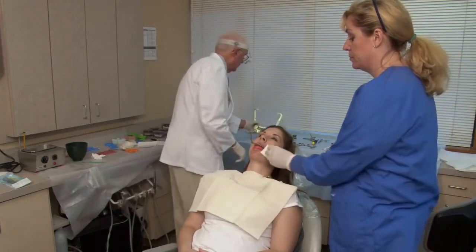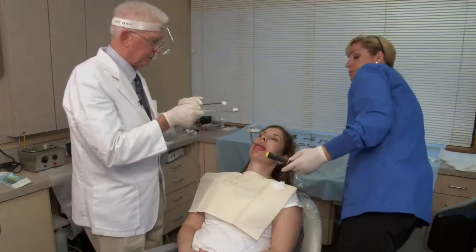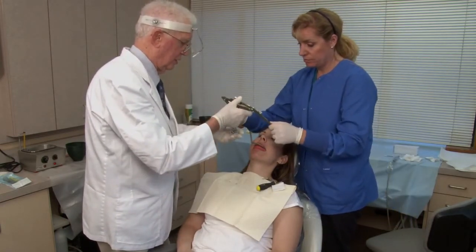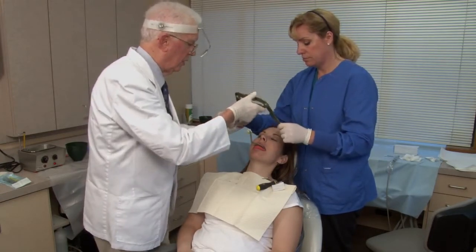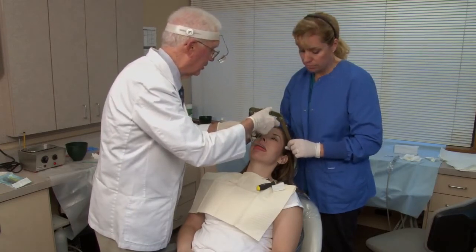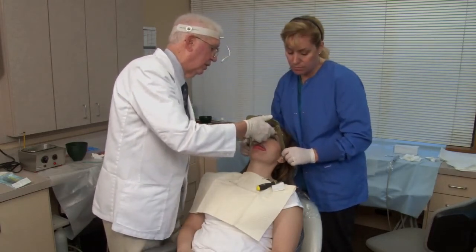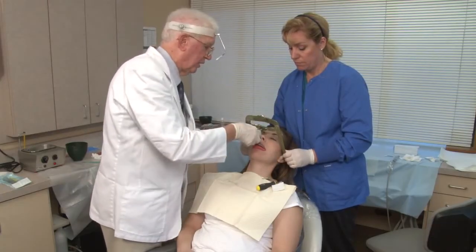Now we get the ear bow and the hex wrench. And Christy will start putting it into the ears slowly as I seat it onto the bite fork stem. Okay, keep going toward the ears. Keep going. Tell me when you get there. Push it in. Push it forward. I lock it. I've locked the width.